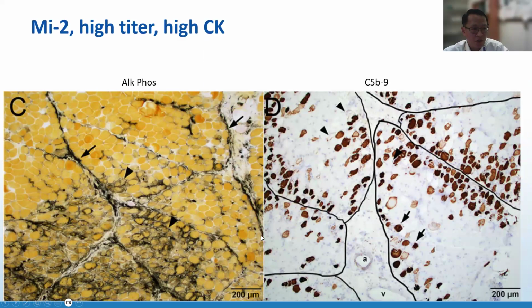Necrotic fibers and regenerating fibers can be better highlighted by these immunostains. So C5b9 is also called terminal complement complex or membrane attack complex. The strongly stained fibers with sarcoplasmic staining are necrotic fibers. You can see they have this general distribution along the perimysium, and the perimysium is highlighted by these black lines here. And the alkaline phosphatase shows this dark connective tissue stain, which indicates connective tissue damage, and also highlights all these regenerating fibers and necrotic fibers in this involved zone.